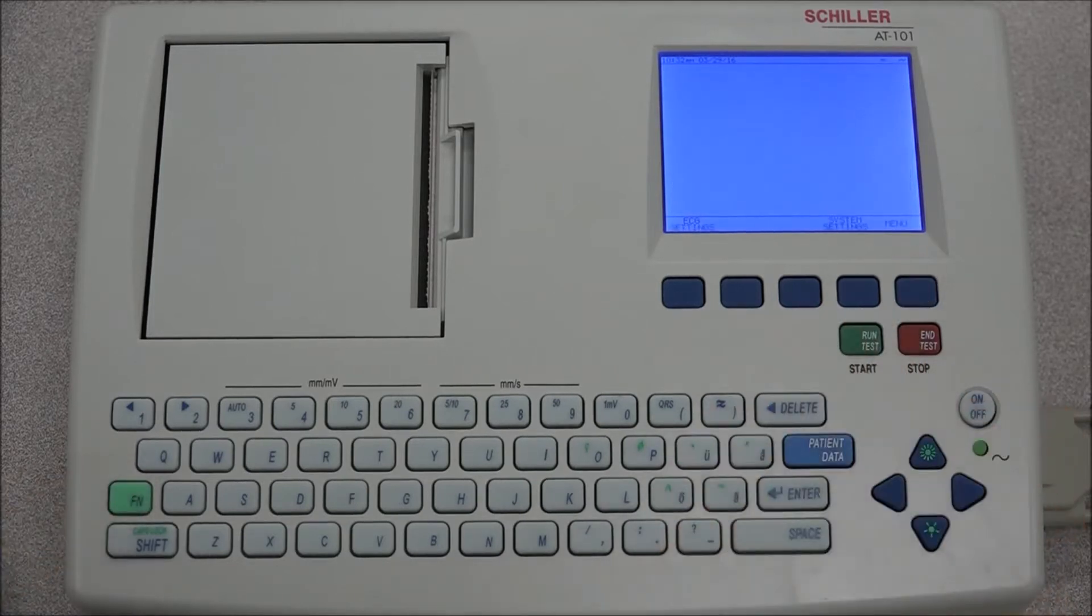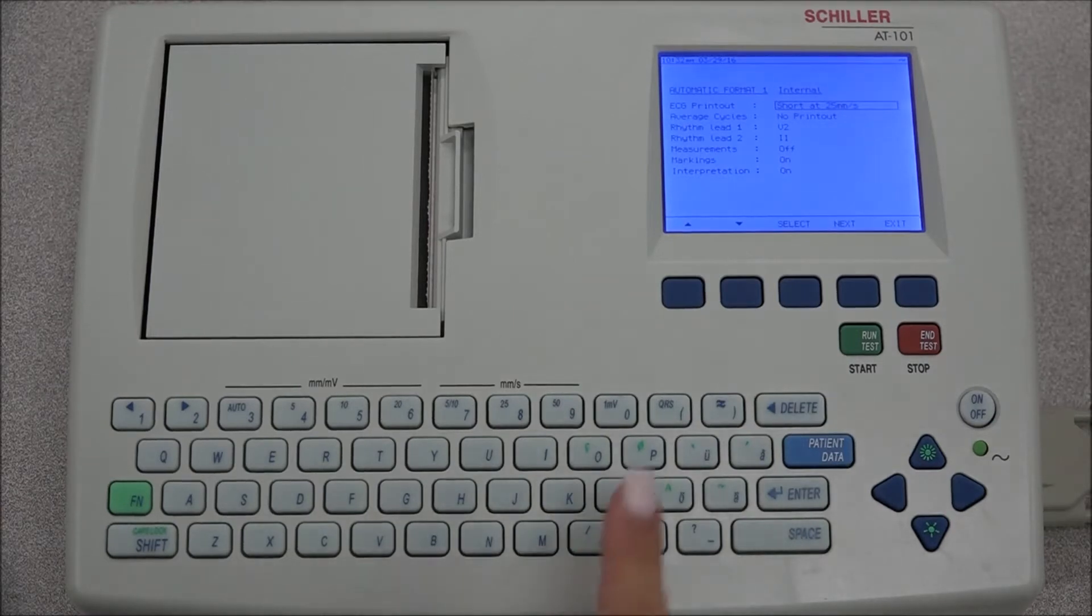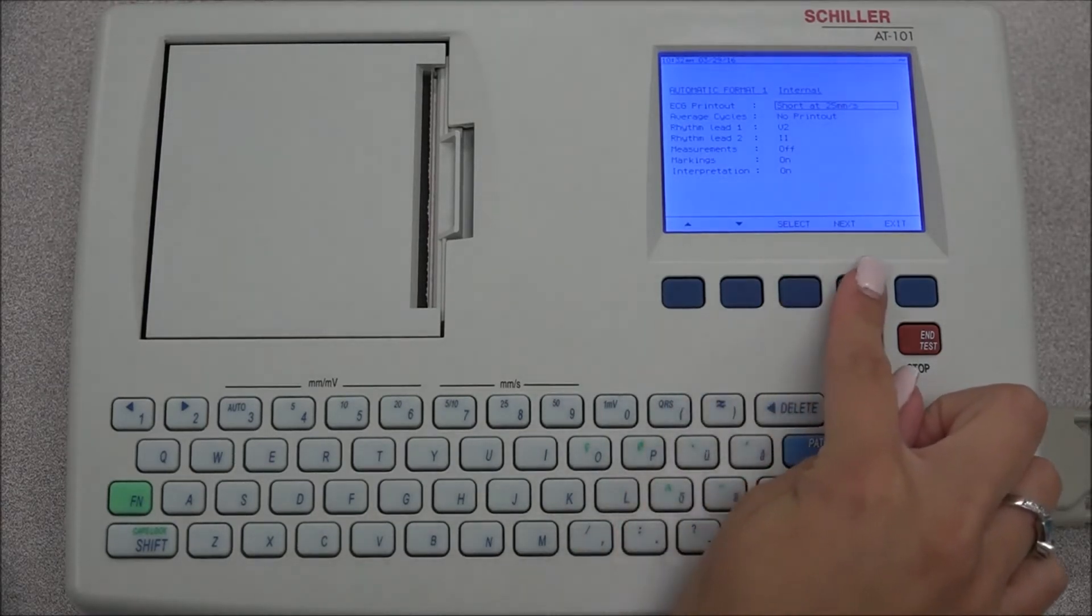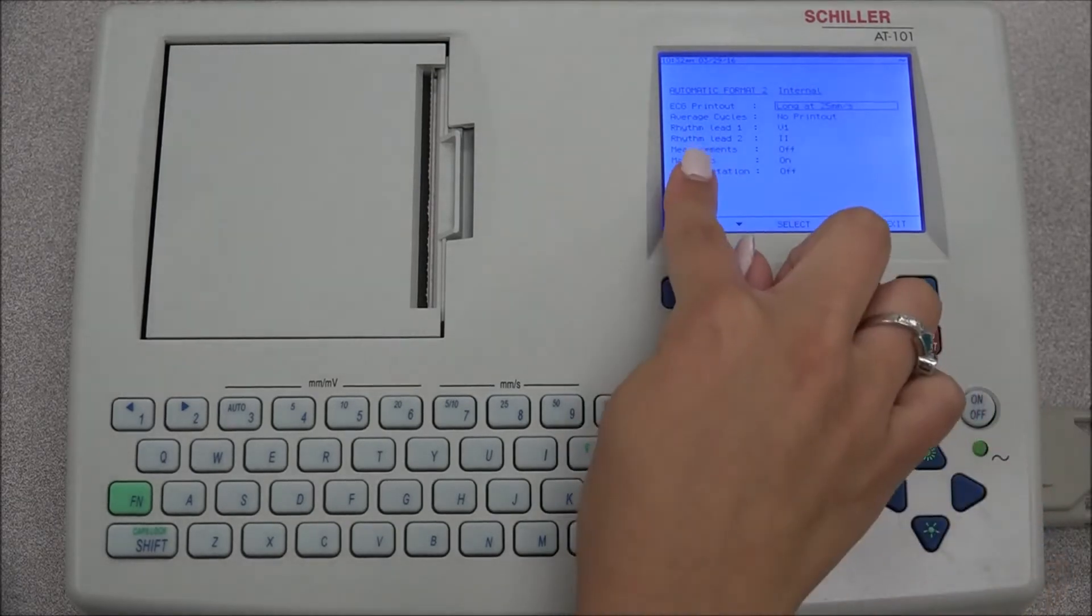When the setup key has been pressed, the ECG settings and system settings will be displayed. To configure the ECG settings, select ECG. Various tabs will become available that will permit the configuration of those parameters.